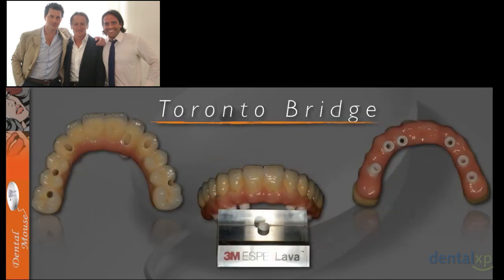And you see here the final Toronto bridge. And it's important also to use a good quality zirconia, because right now there are a lot of zirconias available in the market, but of course you can have good aesthetic rehabilitation, a good aesthetic result, if you use a quality zirconia, because not all the zirconia are the same, not all the zirconia answer the same way after the bakes, not all the zirconia has this many possibilities, this many colors. So it's important. It's another detail that we put in our treatment plan.